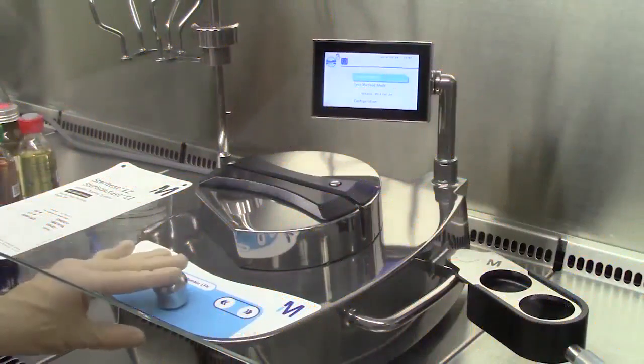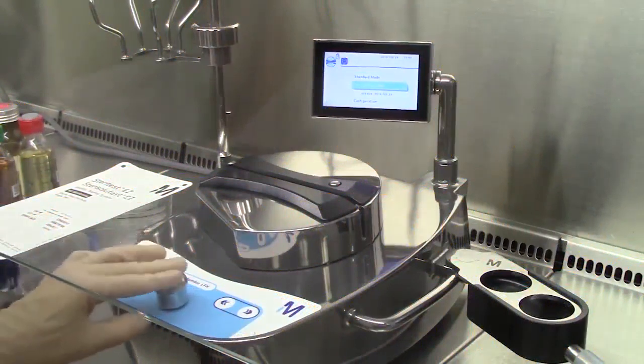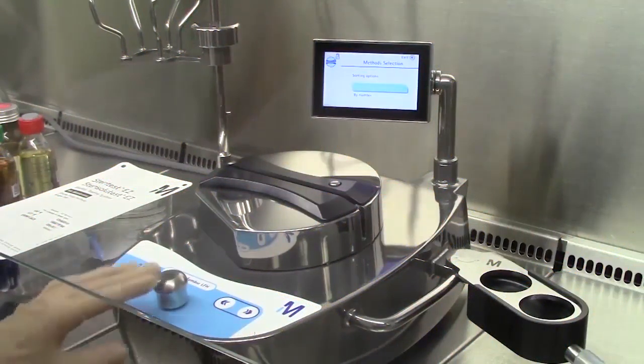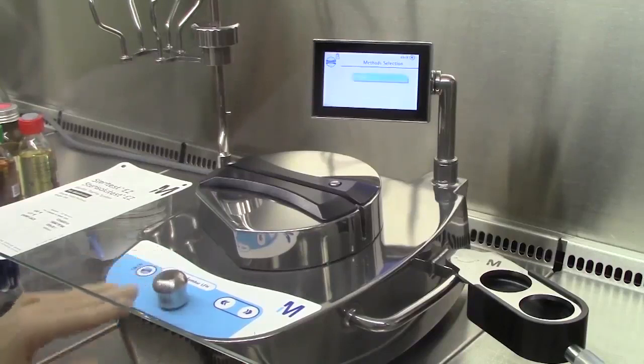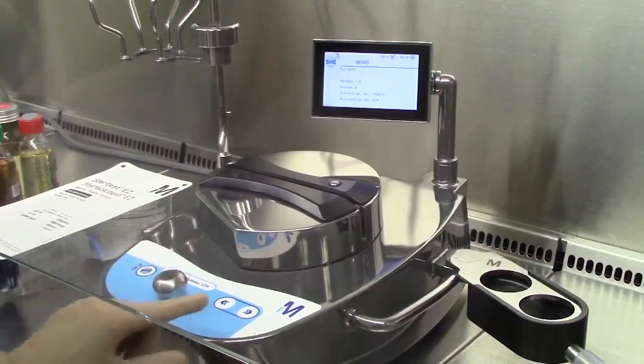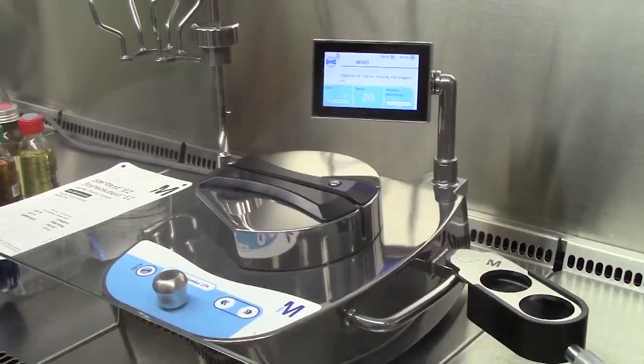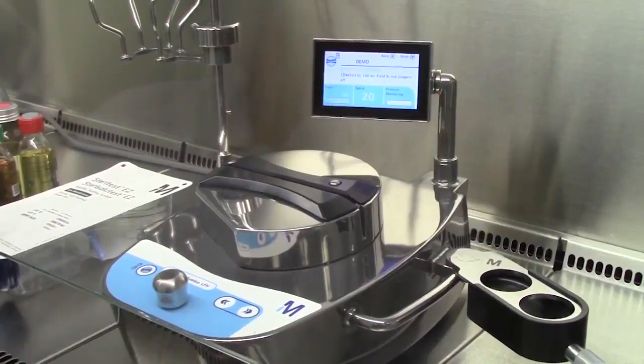From the main screen, turn and press the control knob to select either the test method mode or the standard mode. With the test method mode, the operator simply follows a pre-loaded procedure in the pump. The test methods can be created on a computer using the Steritest Symbio software and transferred to the pump either by a network cable or a USB flash drive. In this video, we will use the test method mode with one example of a typical SOP. However, each customer will have a specific SOP which applies to their own product.